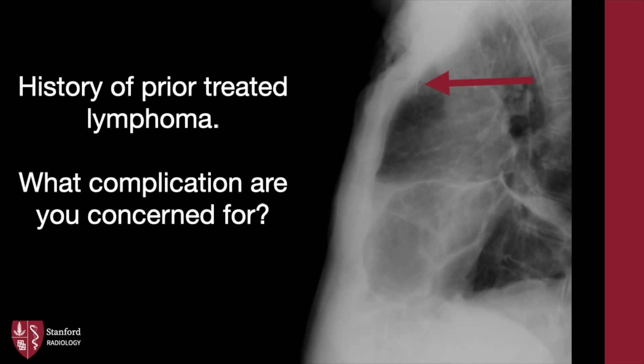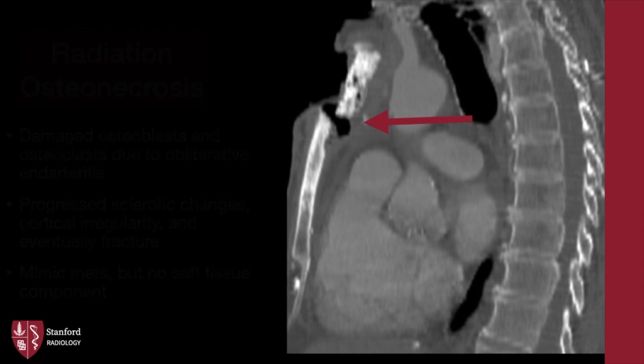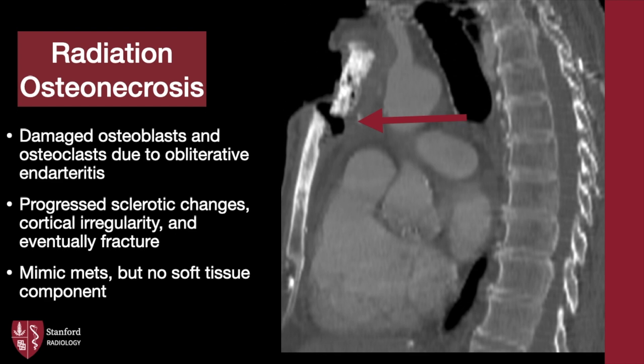Our next patient has a history of prior treated lymphoma. What complication are you concerned for? A sagittal CT shows ill-defined sclerosis with an anteriorly displaced fracture of the upper sternum. Patients treated with radiation may develop vascular compromise in bones within the port field. Radiation osteonecrosis may lead to progressive sclerotic changes, cortical irregularity, and eventually fractures. While the findings may mimic metastases, radiation osteonecrosis typically lacks the soft tissue component.